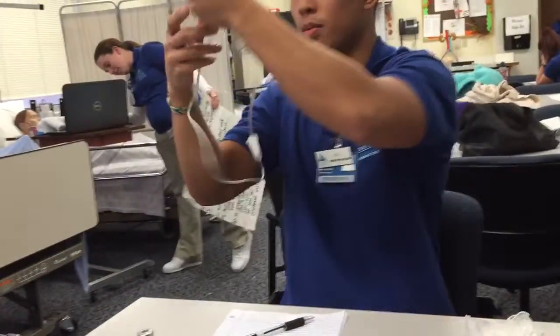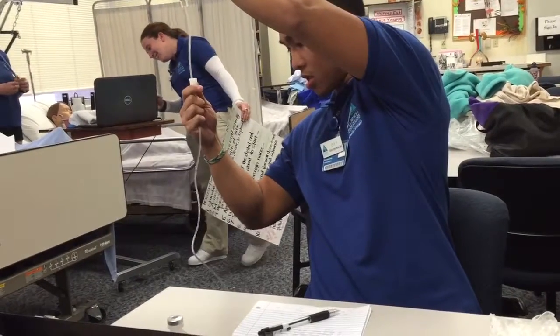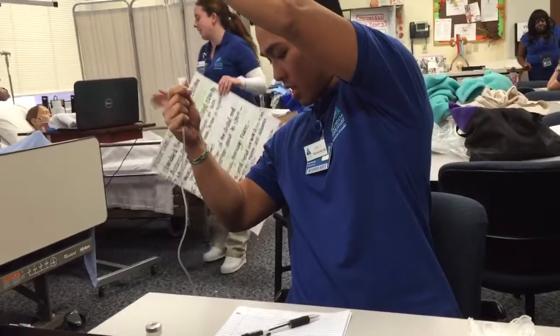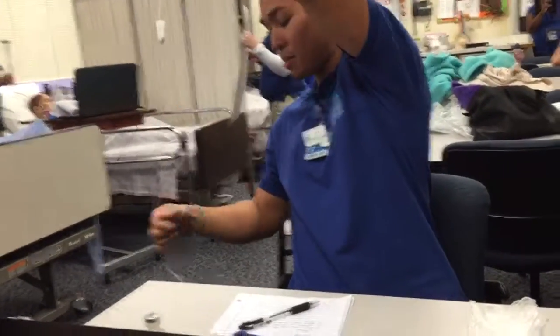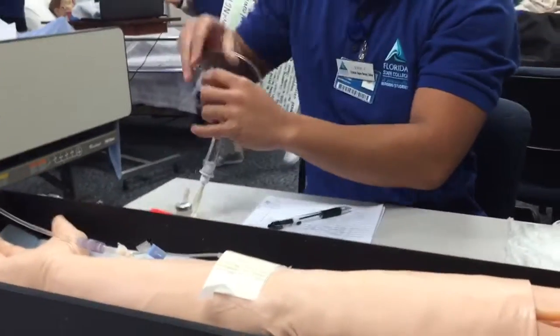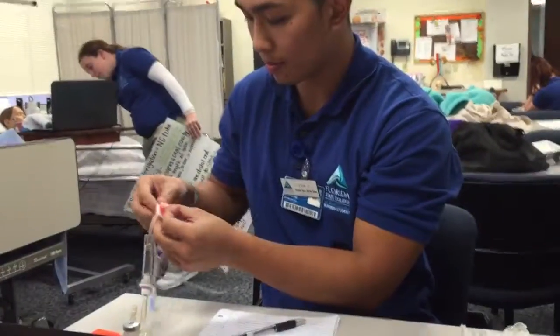And I'm going to let it run out a little bit so all the air bubbles are gone. It is to prime the tubing, and it looks good. I'm going to close that clamp up one more time. I'm going to go ahead and label the tubing also with the date, time, and my initials, just so we can know when the tubing needs to be changed. So that's good to go.